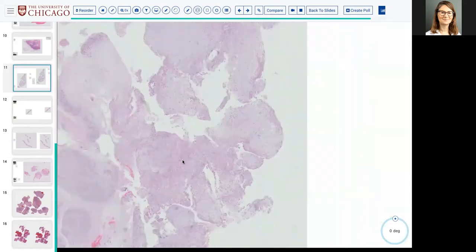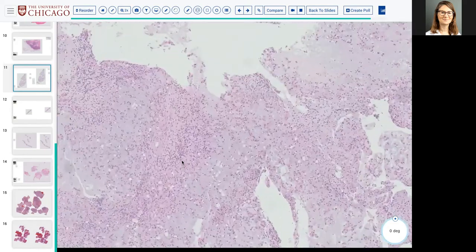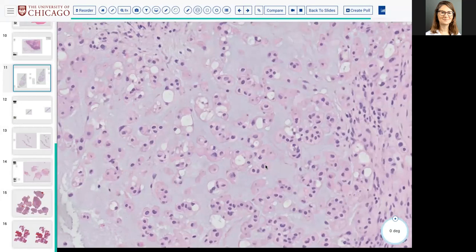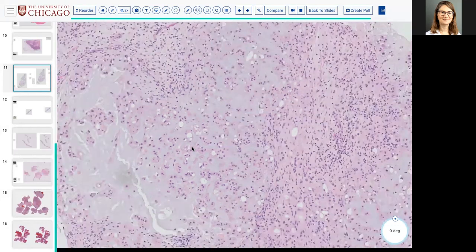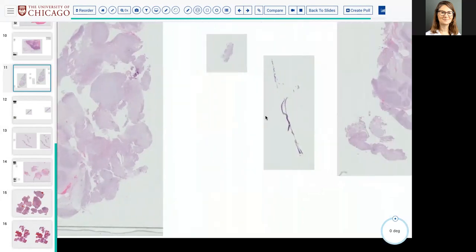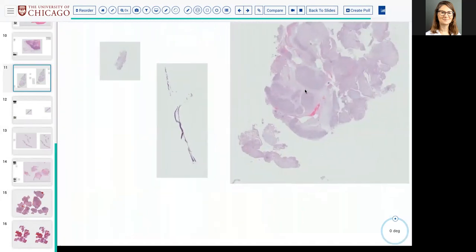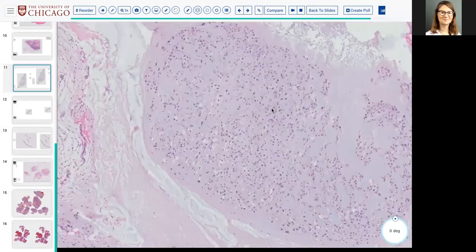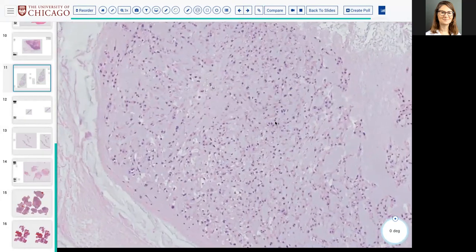Myoepithelial tumor can absolutely come into the differential because, as you saw, the morphology, the arrangement of these cells is extremely similar within this myxoid background. But the glassy cytoplasm and the bubbly vacuoles almost sort of give this away. And I didn't want to tell you the location of this because as soon as I did, you'd know it, right? Like it's at the base of skull, or it's at the sacrococcygeal area. Once you have that clinical information, you jump to a diagnosis.